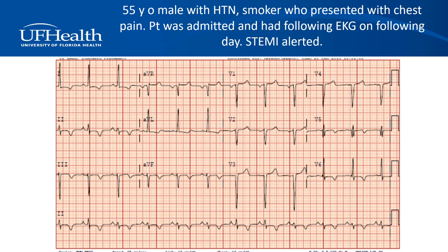The EKG here shows minimal ST elevation in lead V3 and T-wave inversions in the inferior and lateral leads. These do not meet STEMI criteria. The EKG is suggestive of left ventricular hypertrophy, and additionally, the patient had elevated blood pressure at the time the EKG was done, and thus the EKG changes are likely due to repolarization abnormalities. The STEMI alert was canceled.